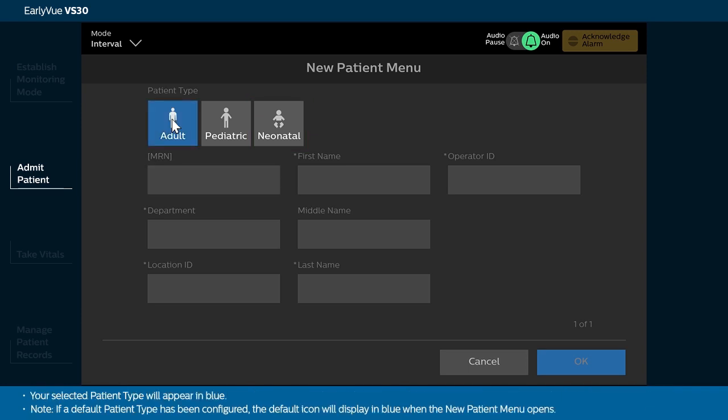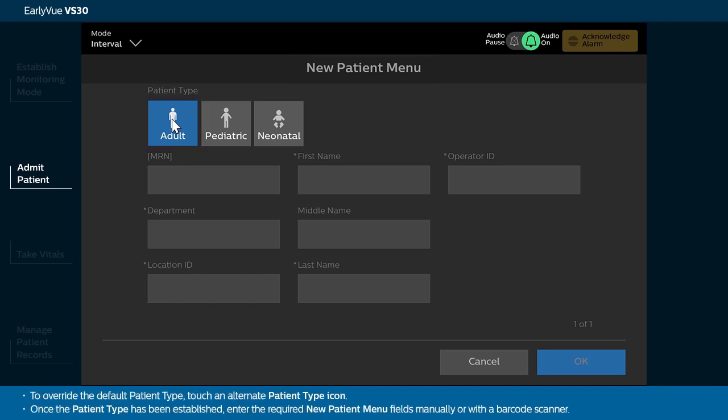Your selected patient type will appear in blue. Note, if a default patient type has been configured, the default icon will display in blue when the New Patient menu opens. To override the default patient type, touch an alternate Patient Type icon.